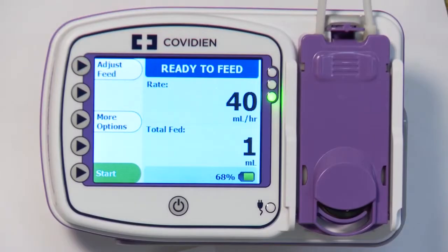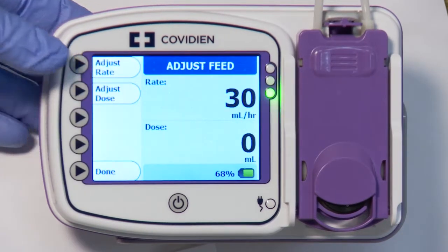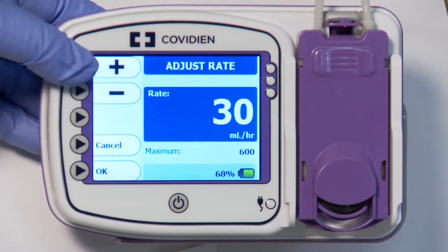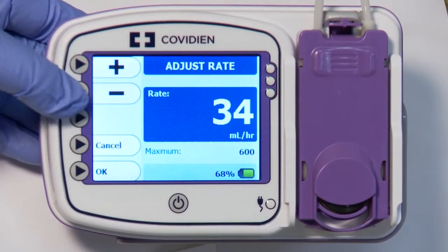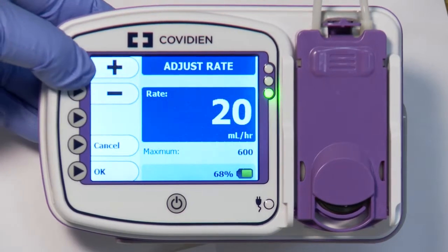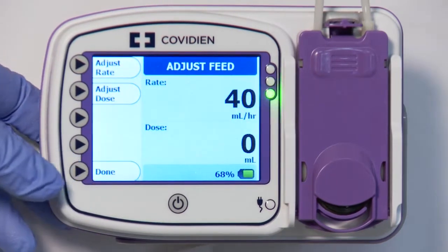Upon completion of the prime, the Ready to Feed screen will appear. Press Adjust Feed, then Adjust Rate to enter the feeding rate. Press the plus or minus buttons to increase or decrease the rate. Push and hold on either button to accelerate the numbers. Press OK when finished and Done to return to the feeding screen.